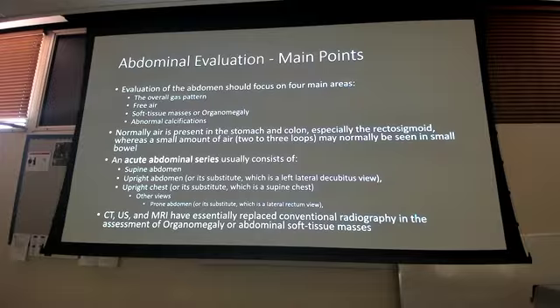Do you expect more air in the large intestine or more air in the small intestine? The large, right? Because the small intestine is what's digesting all of that food from a lot of that bacteria. The gas gets passed, it gets moved to the large intestine. So you should see more air in that. You can have some air in the small intestine, but more air usually in the large intestine. We're going to look at some of that stuff.